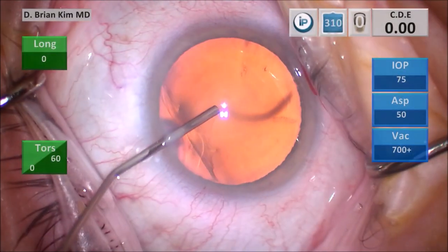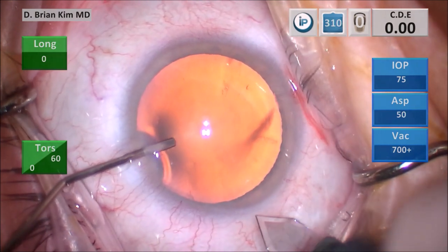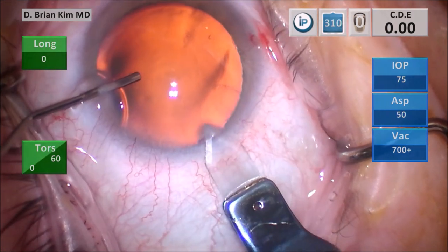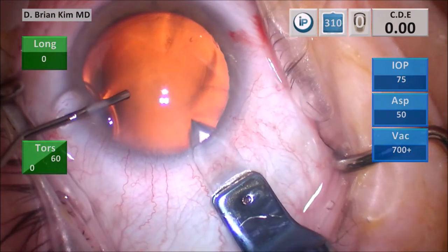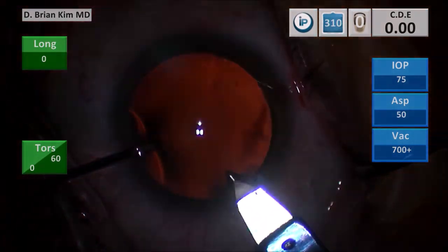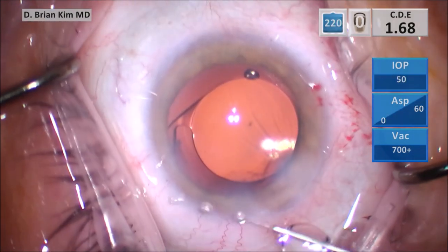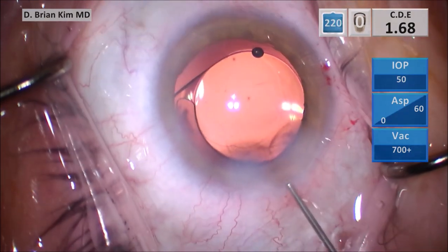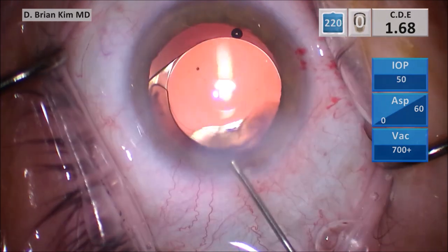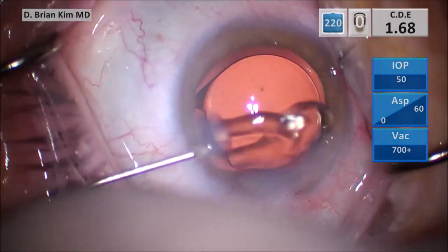Using viscoelastic to fill the anterior chamber, with that same cannula I'm going to help control the eye. I make a vertical groove through the limbus, then place the tip of the blade into the deep part of the incision, tunnel through the cornea, and then dive down to complete the incision. The reason some people have leaky main wounds is because they don't make a grooved incision — the outermost portion of the wound is just epithelium with a sliver of stroma, and there is no structural integrity. By making a vertical groove, you create much more stromal thickness and stronger integrity, allowing a stronger incision.